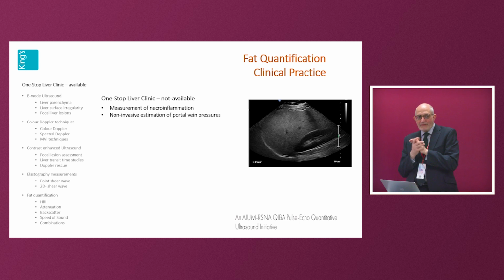You don't have a non-invasive measurement of portal hypertension. This is extraordinarily important in chronic liver disease in children, because the only definitive way of measuring portal hypertension accurately is transjugular wedge pressure measurements. But this is changing as well. You can tell the portal pressures externally with ultrasound, and this is done by Flemming Forsberg out of Thomas Jefferson, and he's publishing quite a bit now.